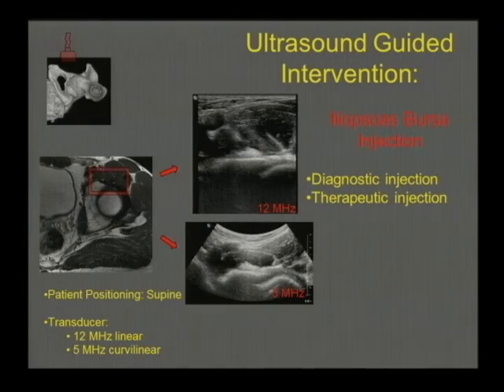So we begin the examination with diagnostic evaluation of the iliopsoas tendon itself, looking for a possible collection of bursal fluid. Again, sometimes we see fluid that elevates the tendon a little bit and extends medially and laterally.